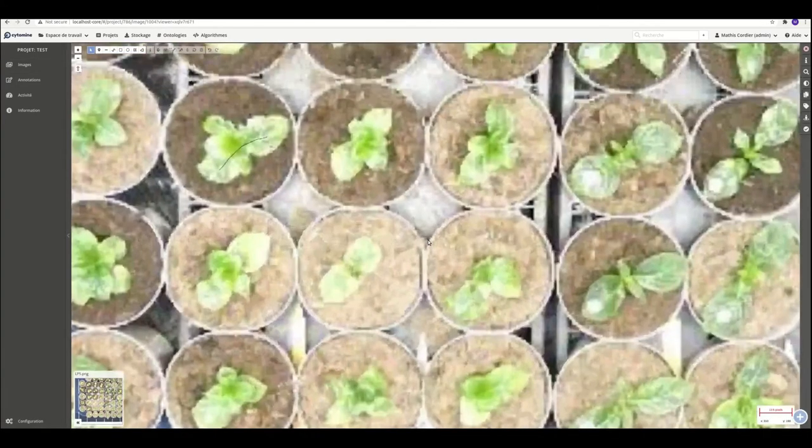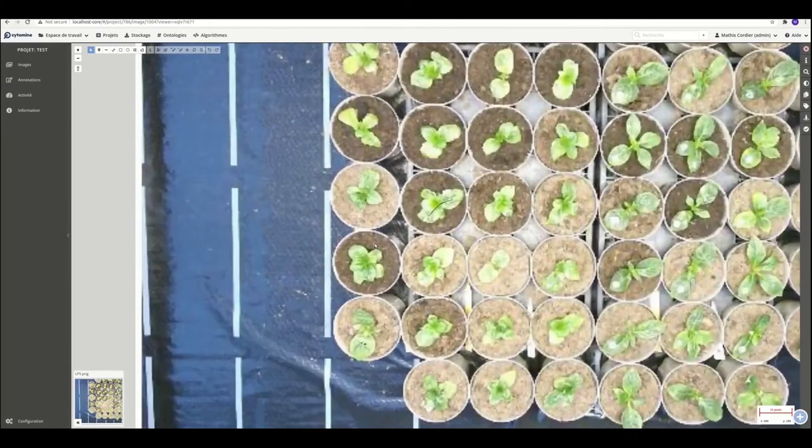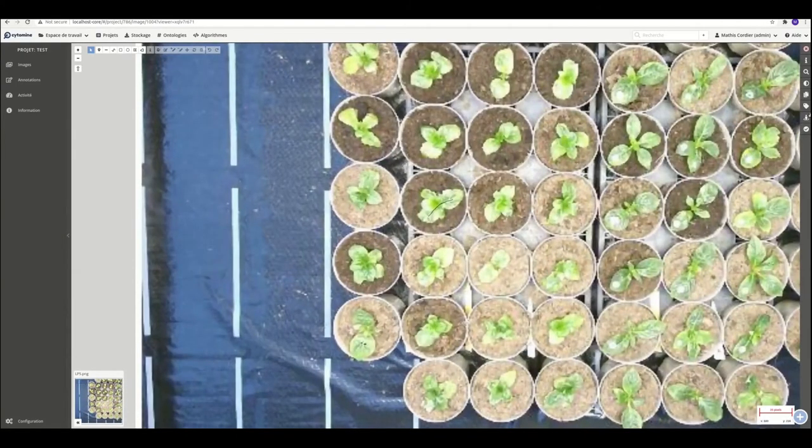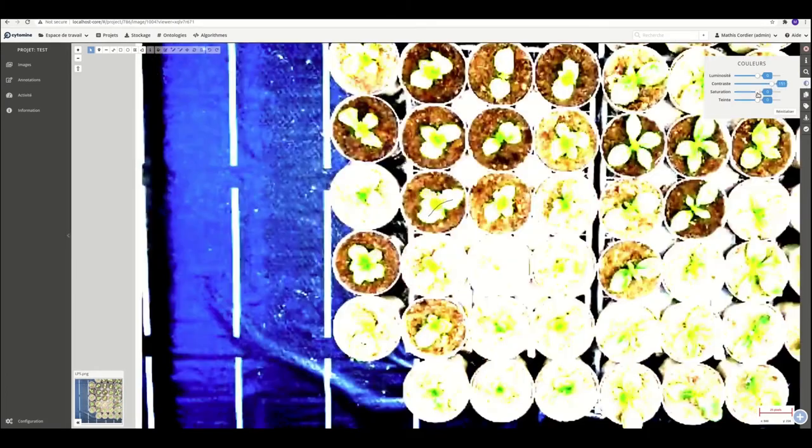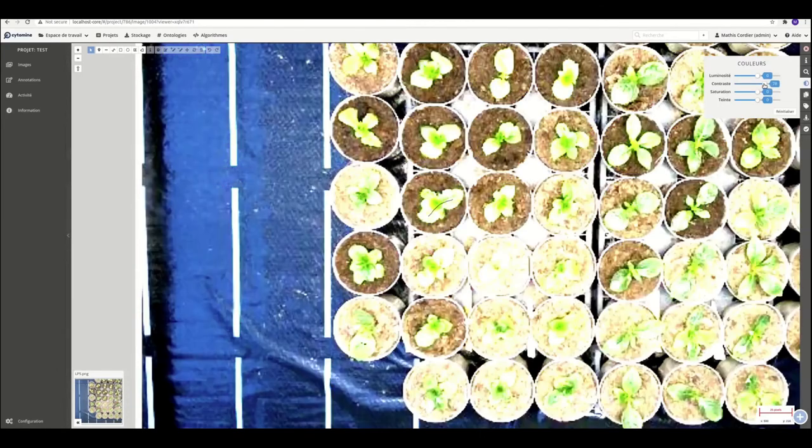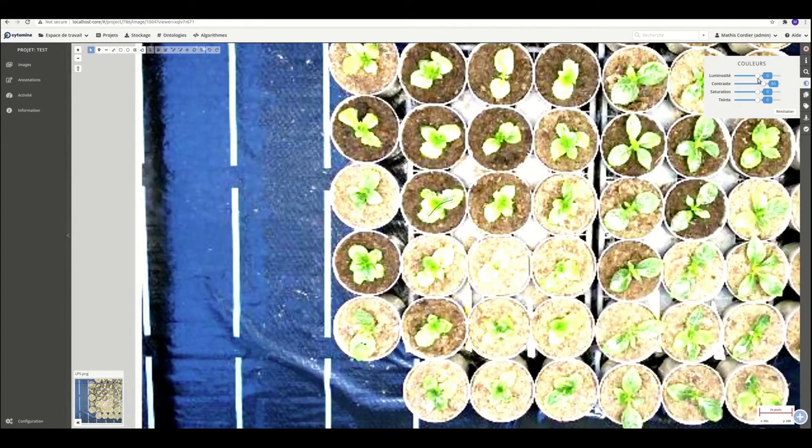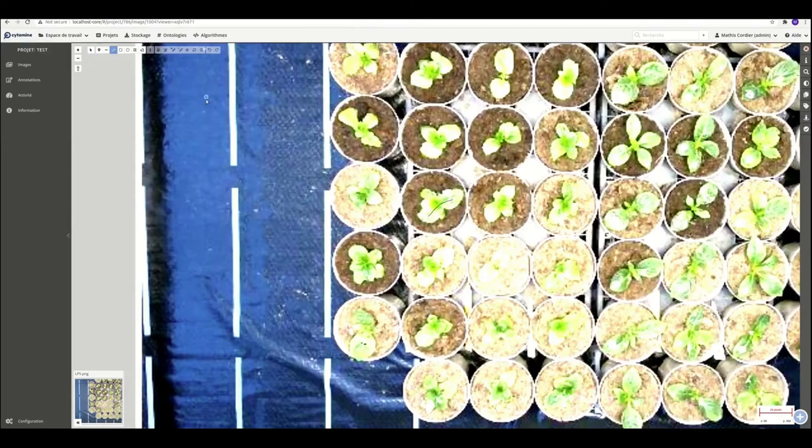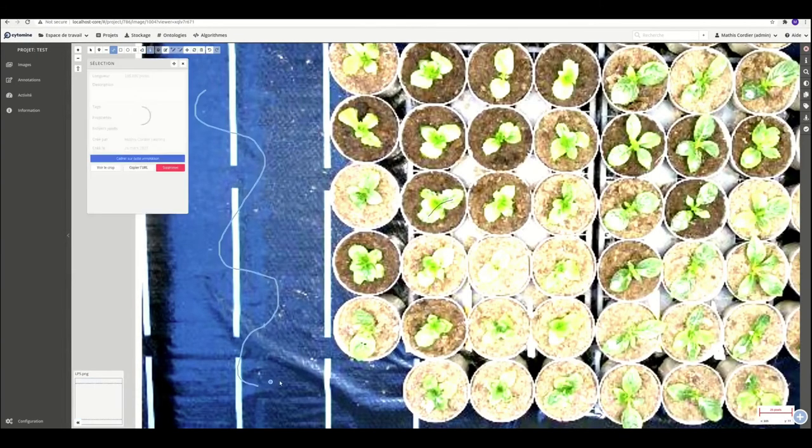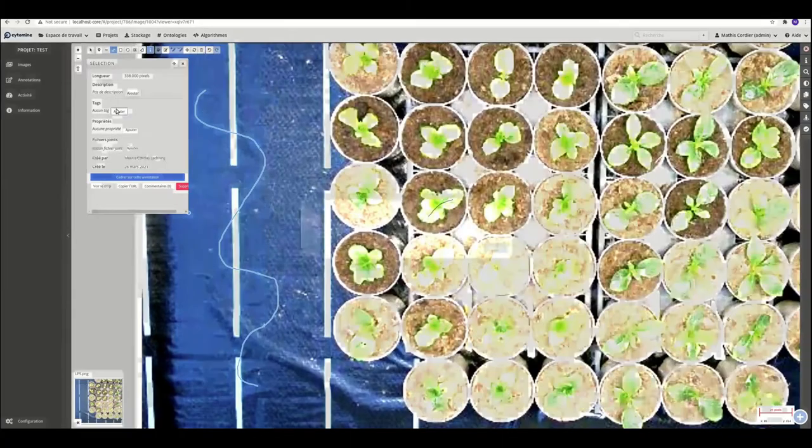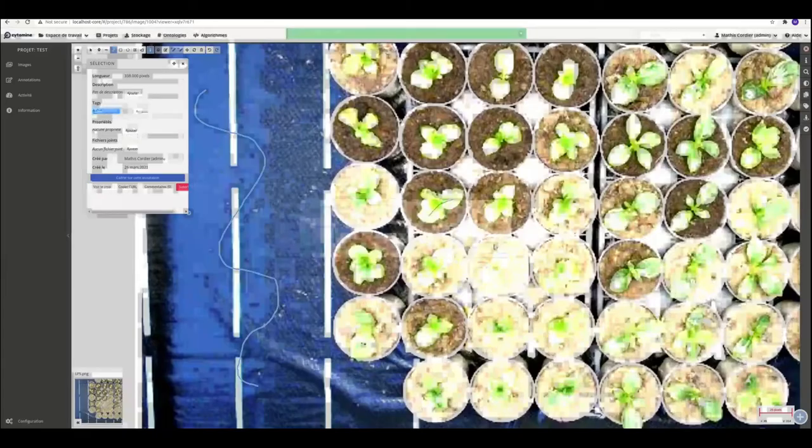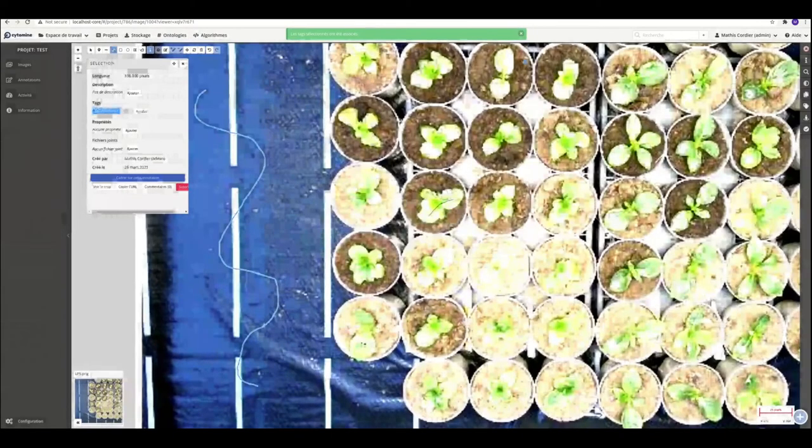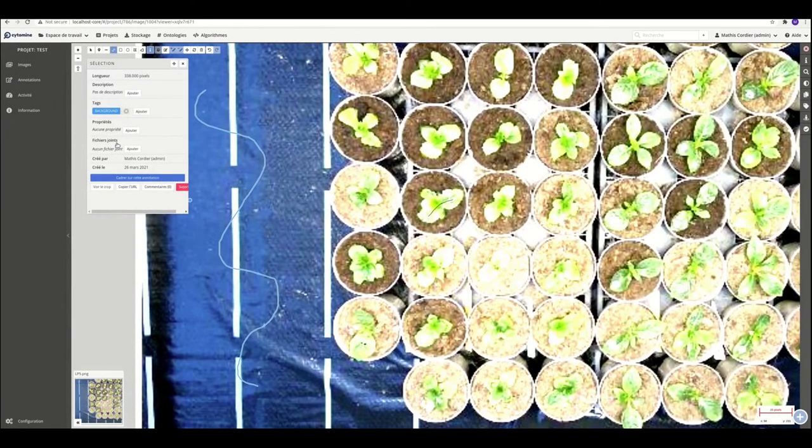So you can zoom, de-zoom. And so with that software, you can adjust brightness, contrast, saturation, or hue of the image to better see the pixels of the images. Also, you have a lot of shapes to annotate. Here it is a line to annotate the background. And you have all the metadata for just that annotation. So we also have the length of the annotation, etc.